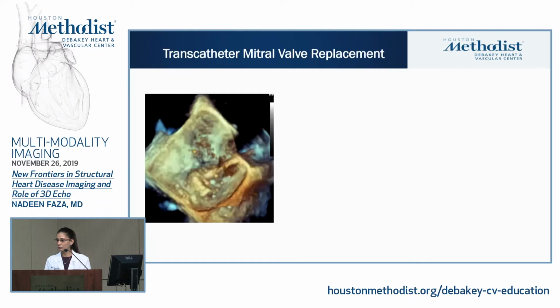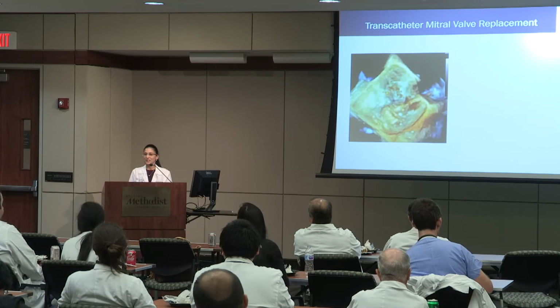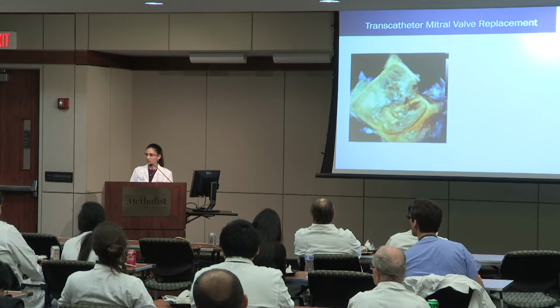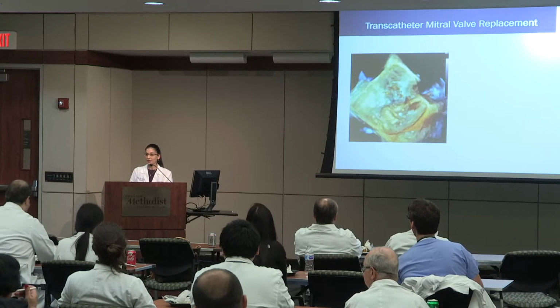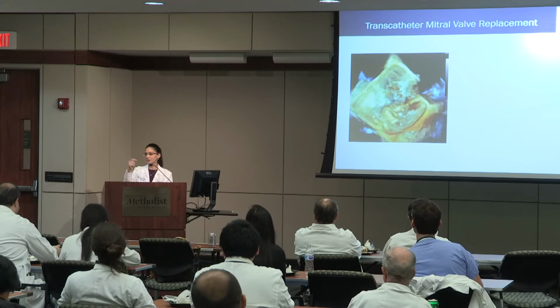What is the role of fluoroscopy during all this manipulation that you talked about? So fluoroscopy is... You're not doing any fluoroscopy? Is everything guided by 3D? I think we do minimal fluoroscopy, of course, advancing the catheters and the wires. But in terms of positioning the clip, it's all 3D guided.